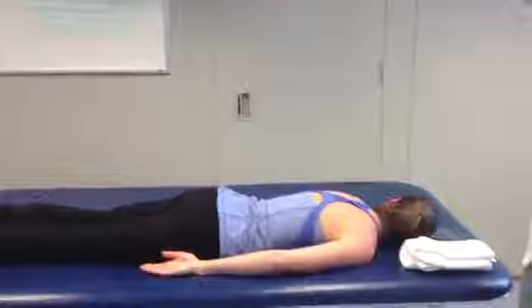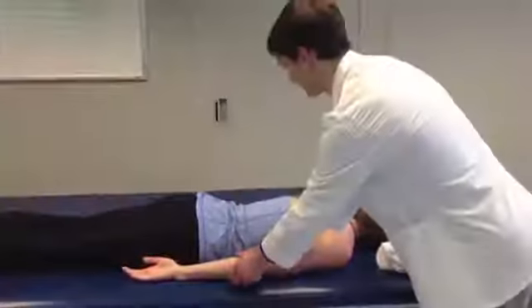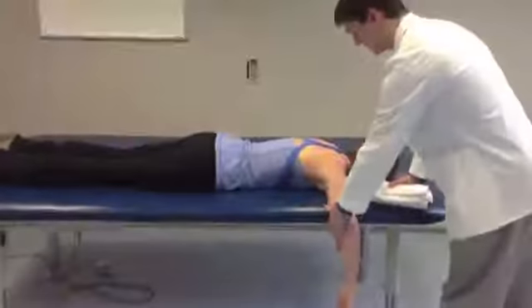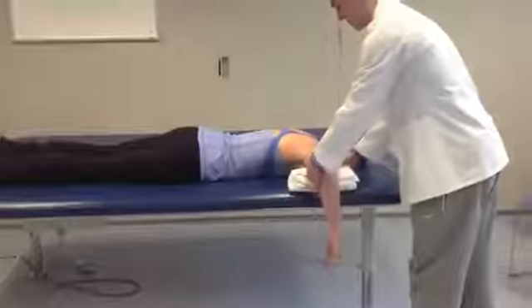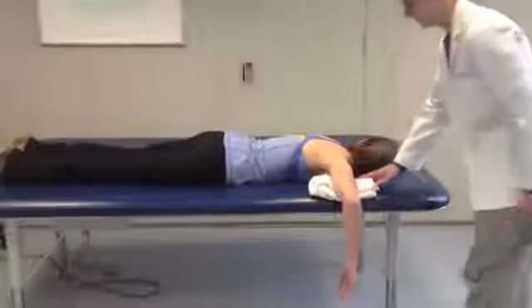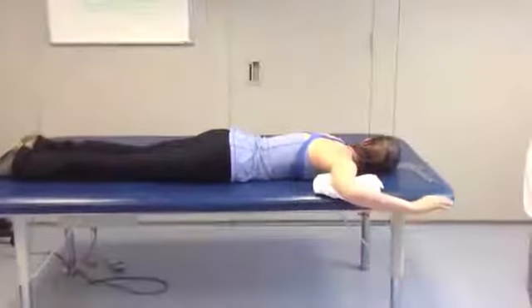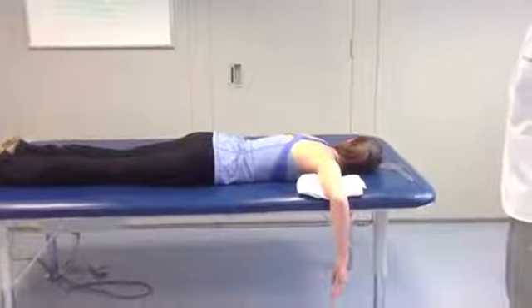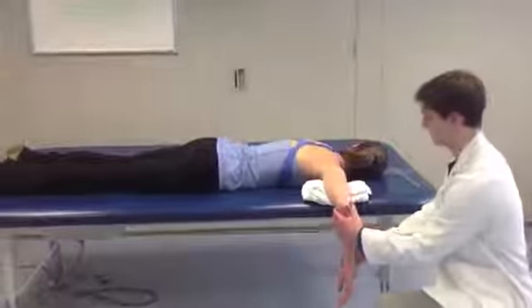Have the patient abduct to 90 degrees with the elbow flexed 90 degrees. Request the patient to demo active range of motion. Put the patient through passive range of motion, making sure that they can zero.